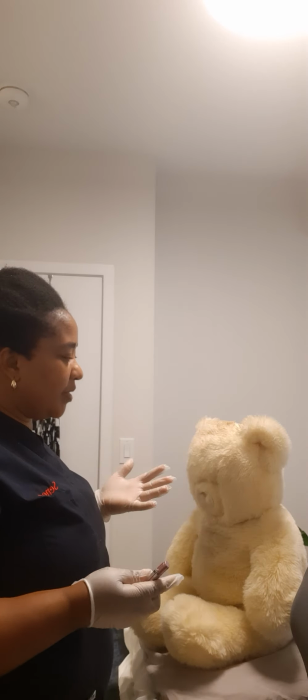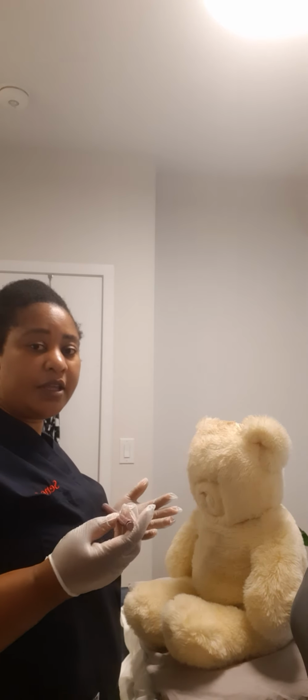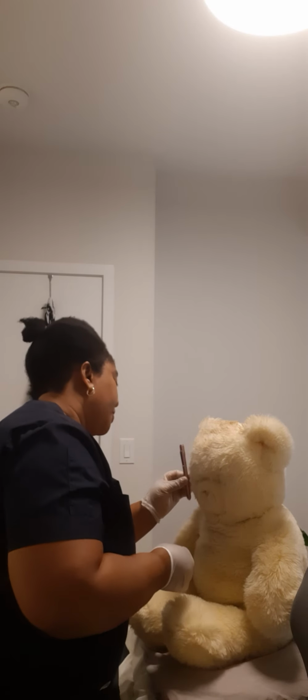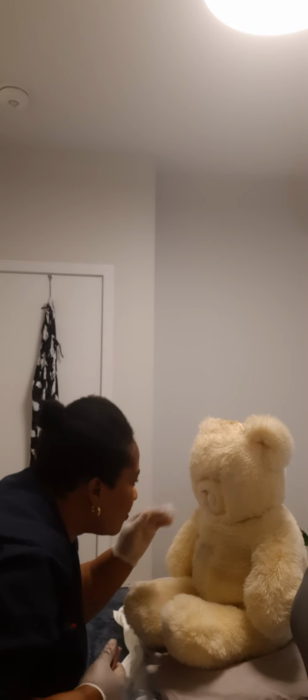Then I'm going to be testing CN3, which is the oculomotor. Then I'll start with the pupil size. So for the pupil on this side, I'm seeing 4 mm. To this side is 4 mm. Then for symmetry, both eyes are equal. Then for the shape of the eyes, they are both round.